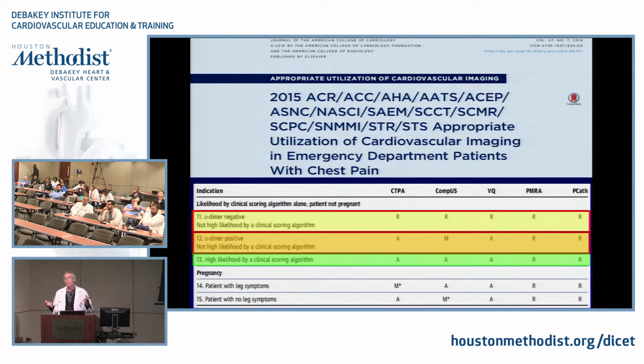I mean, you have to remember that everything in the chest moves, everything. It's not just the heart. The heart affects everything in terms of the pulmonary artery motion, everything. So the only thing that's actually stable in the chest is the descending thoracic aorta. And the reason for that is because it basically sits entrenched on the spine almost, and is completely covered over by various mediastinal membranes, okay? So it actually stays pretty stationary.